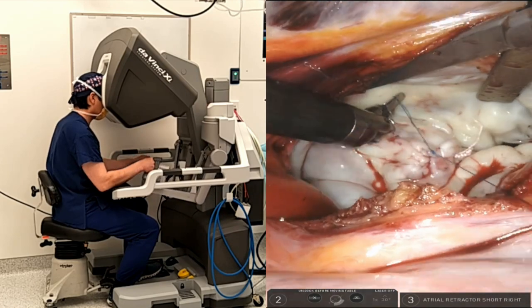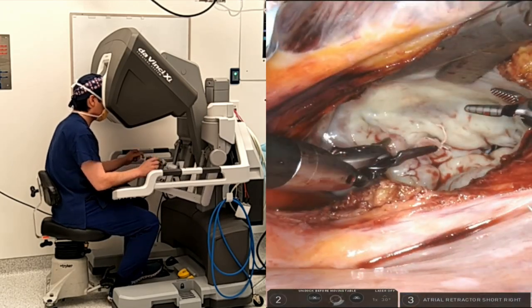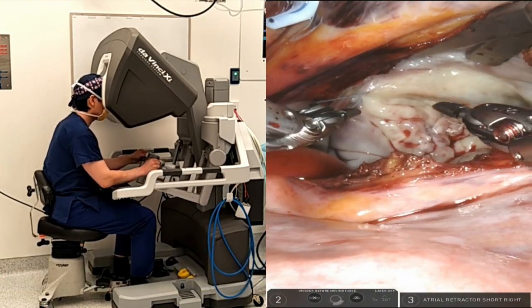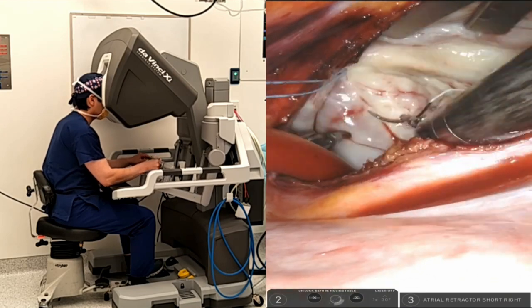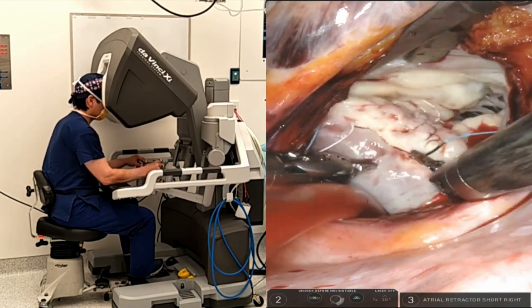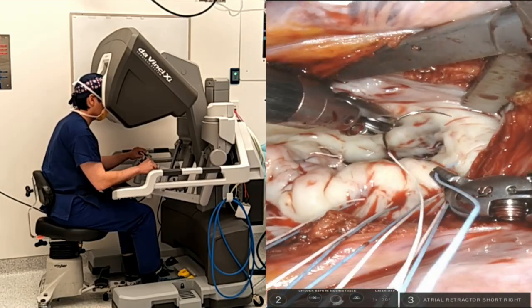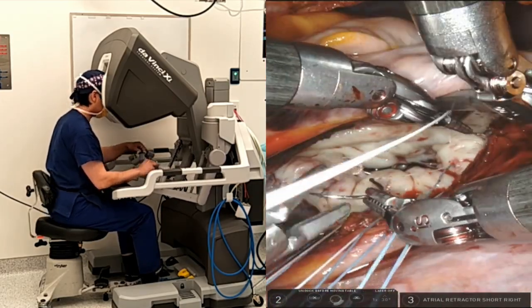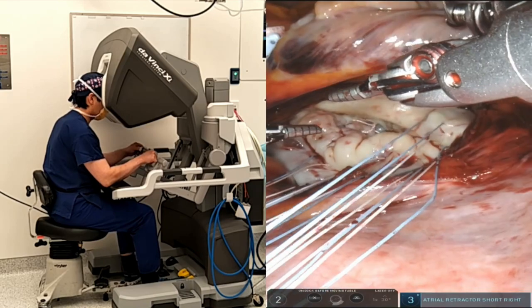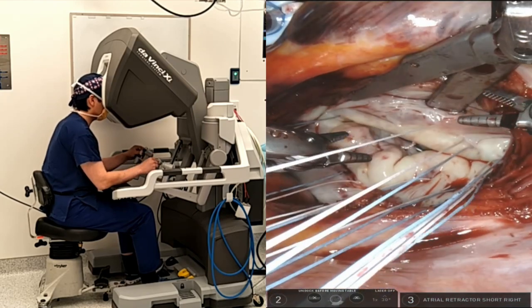Next is placing the mitral annuloplasty sutures. I do this the same way as I would in the open or thoracoscopic approach using interrupted Ticron sutures. Here we can appreciate calcification along the P1 segment of the annulus. When I come around to the anterior annulus, I tend to use my left hand to stitch to avoid overstretching on the atrial wall. The robotic platform enables surgeons to operate ambidextrously, which is extremely convenient indeed.